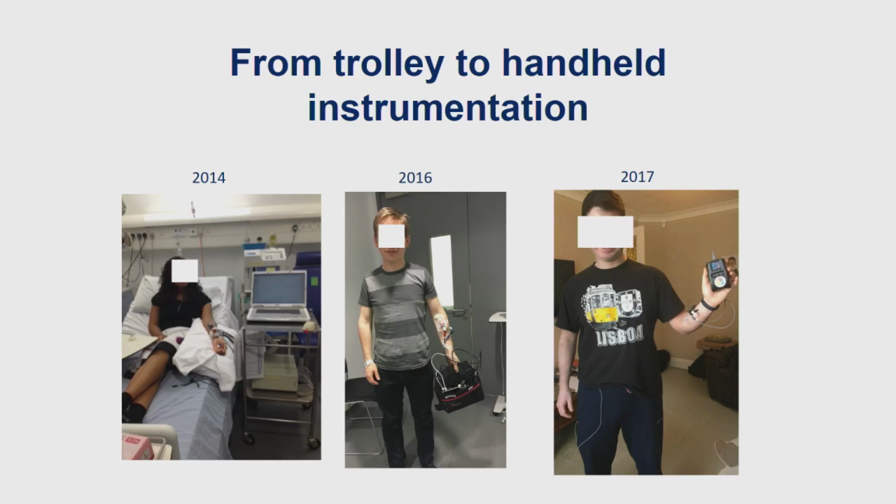You can't, right? So you need something which is much more discreet, something which looks more like this PCB based device, which can hide under the collar, or you can tag it to the collar or something like that, which is light as well. Just imagine putting a 5 kilo potentiostat around the neck of a cow. It will stop moving around, and then you can't say, oh, it's not tolerating it very well, because you've given it too much weight there. So you need devices which are not just low cost, but which are also convenient, right?